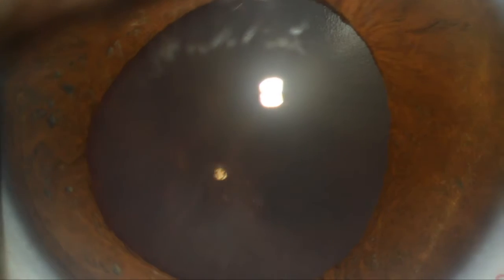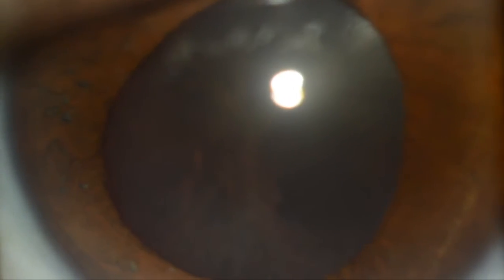The patient is a 63-year-old white female who presented complaining of bilateral decreased visual acuity due to a 2+ cortical cataract in both eyes. Past medical history was significant for previous hyperopic LASIK done elsewhere, controlled hypertension, and the use of trazodone. After routine preoperative evaluation, ocular surface and macular health were found to be within normal limits. After thorough discussion, the patient demonstrated high desire for spectacle independence, and the panfocal AcrySof IQ PanOptix IOL was recommended.